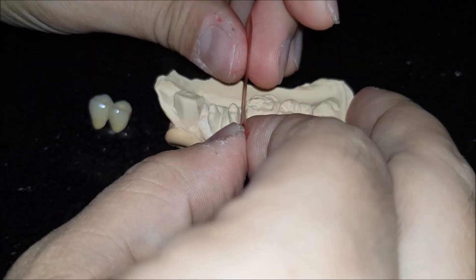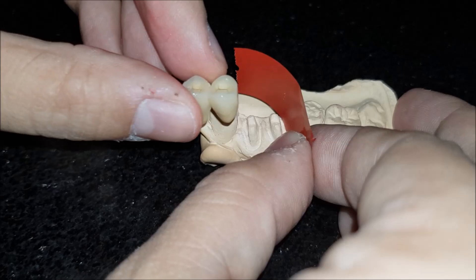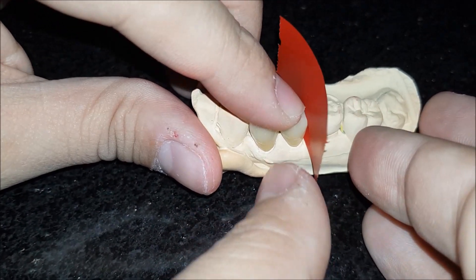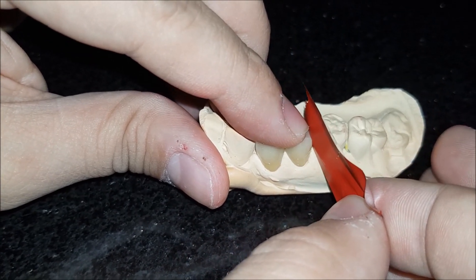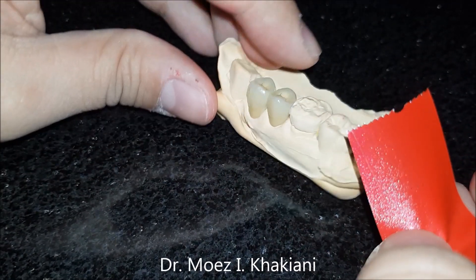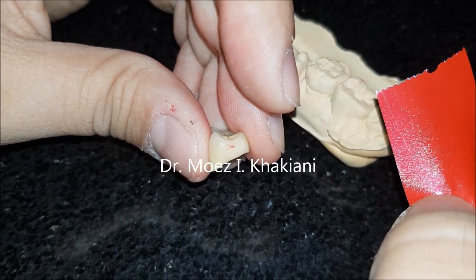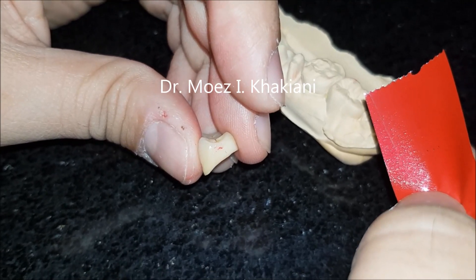What we do is place this on the proximal surface with the color-coated side towards the crown, place the crown onto the cast, and gently try to pull through. As you pull through, it leaves a small mark on the proximal surface exactly where the contact between the teeth is. This is exactly where I want my proximal contact to be.